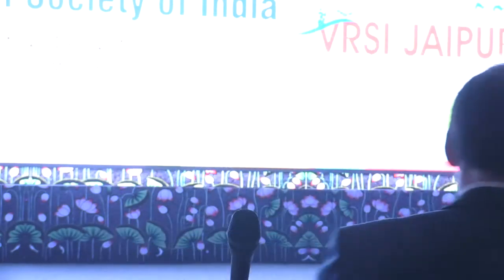Inferior, I'm not. So those who are young bucklers, I think it's a very important point here that you must go ahead and read Dr. Shanmugam sir's article in the Indian Journal of Ophthalmology. It's really good, gives you a very good overview of all the techniques, including finding the break, cryo, and also draining it. So we have a question here from... No, but the issue with young bucklers is first you have to learn indirect ophthalmoscopy. Because with all your wide field, nobody's literally going in for indirect. So without a proper indirect, that's the reason why people have gone for chandelier, so that your life is made slightly easier.